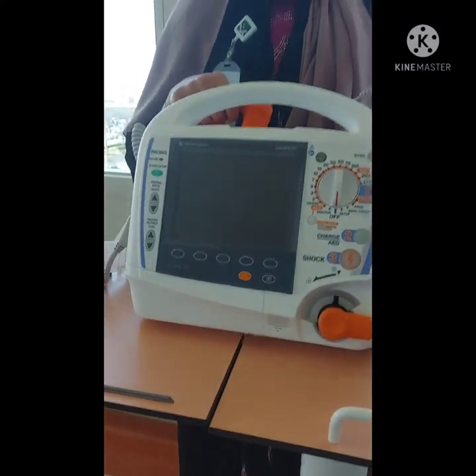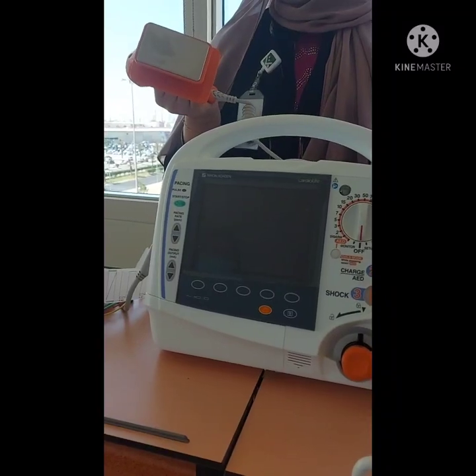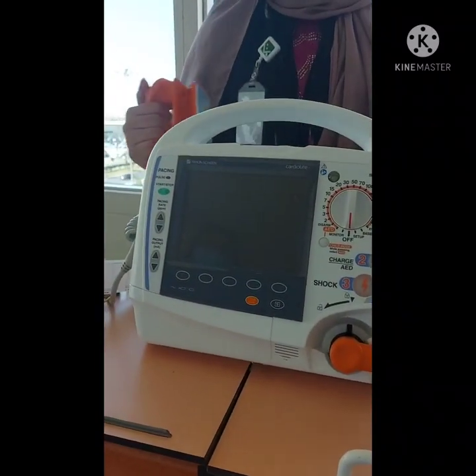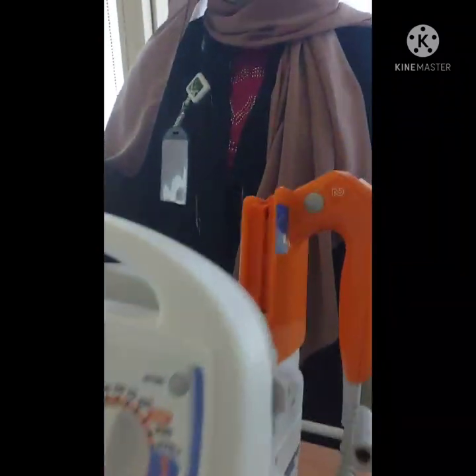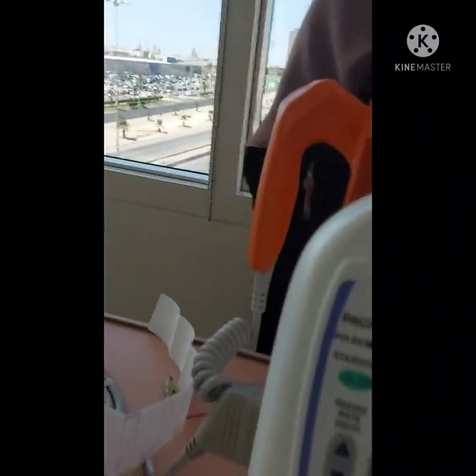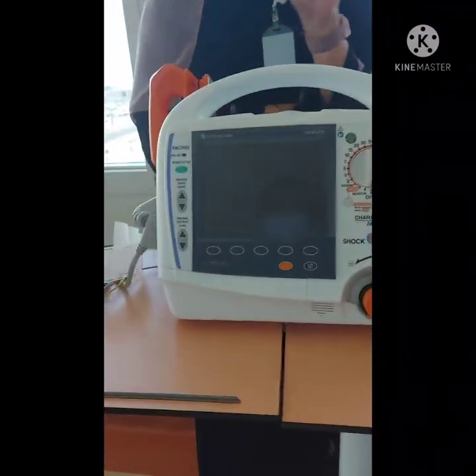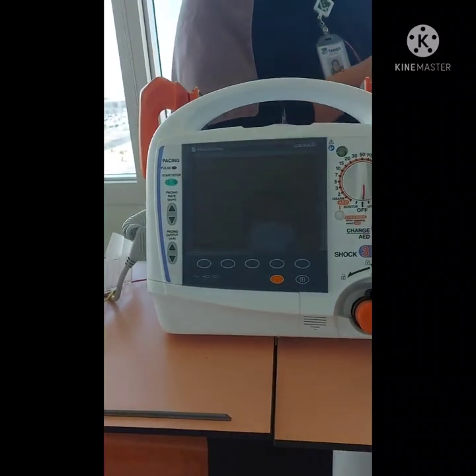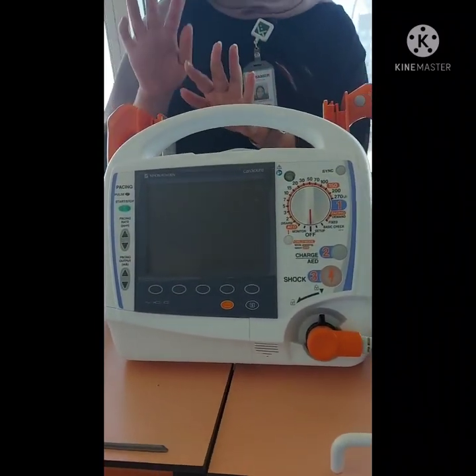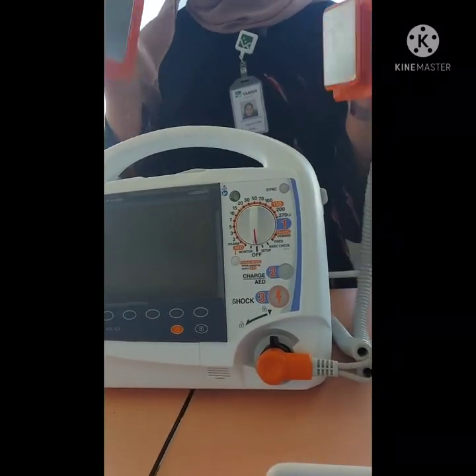Okay. So there is another thing that helps the nurses a lot when you put the gel on the paddles and the patient is not ready yet for the shock. You can just keep the paddles. Sometimes there is the gel, but it's not directly in contact with the patient. You can just keep it like this. It will hold up until 1 minute and 30 seconds until you go and discharge the patient.